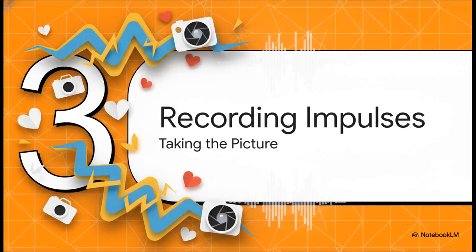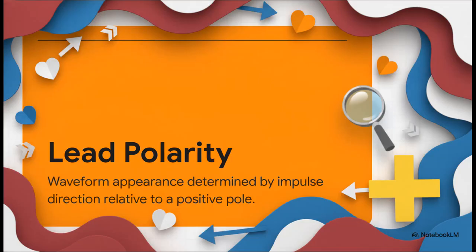All right, into the main event, section 3, recording the electrical impulse, taking the picture. This right here is the absolute core focus of our explainer today. How exactly do these camera angles actually record the invisible force of electricity?